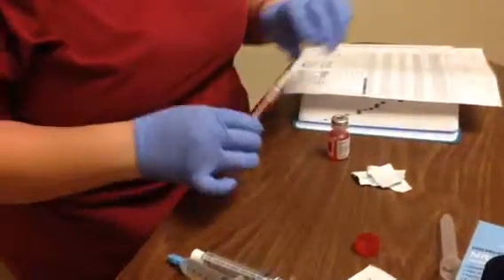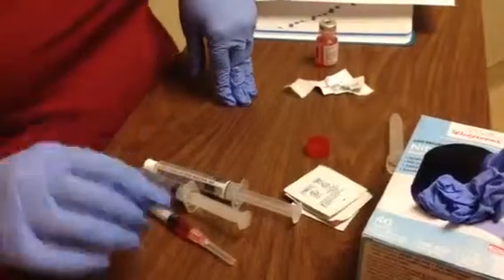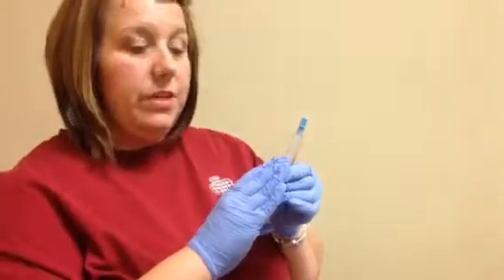So to keep it safe, I want to make sure I scoop. Okay. Go ahead and we're fixing to dilute. So just keep in mind that most of your facilities will have saline injections that are in a syringe. So the way to dilute this, remember our drug book said we needed to dilute with 5 milliliters of saline.